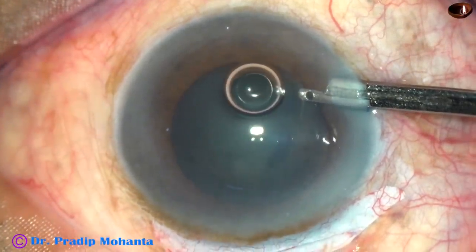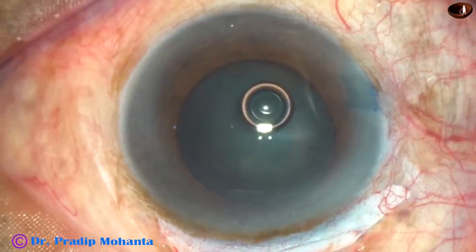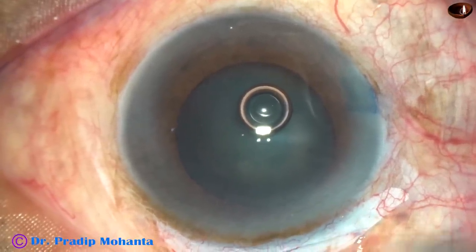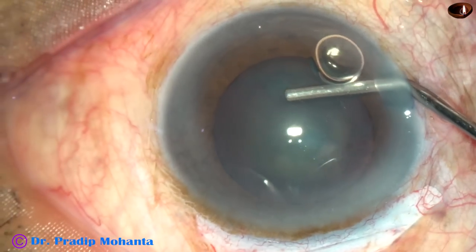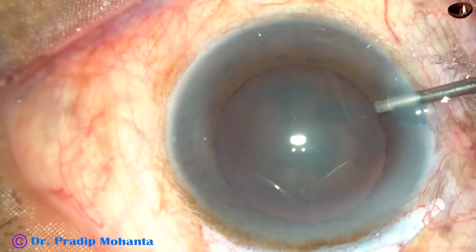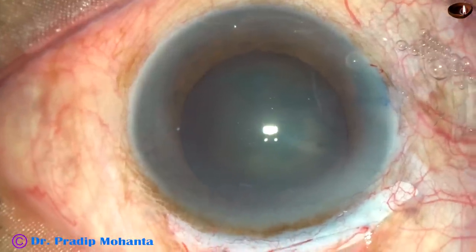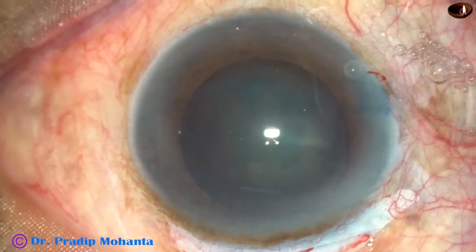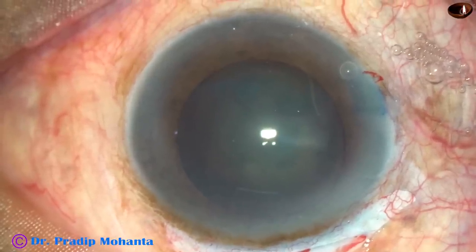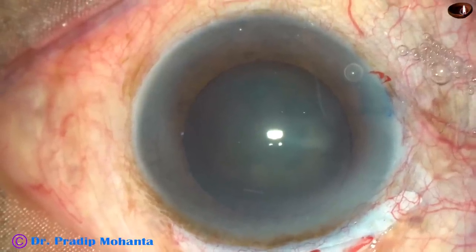Now the dye is washed out, and 2% hydroxypropylmethylcellulose is injected into the anterior chamber. The anterior chamber is filled with this viscoelastic substance. A 26-gauge bent-needle cystitome is used to do capsulorrhexis. Now see how to prepare the cystitome.